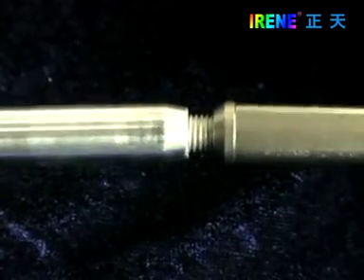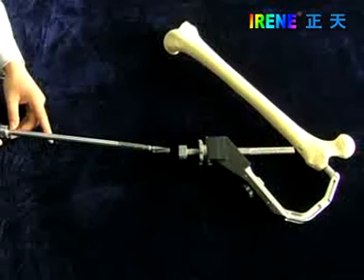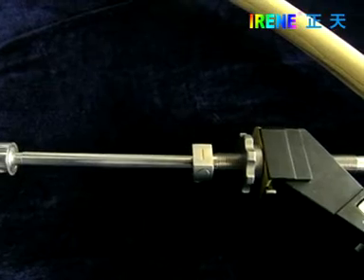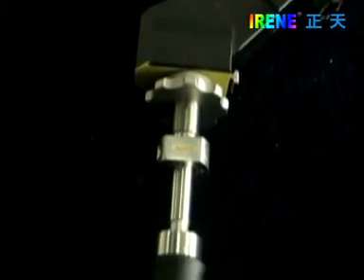Use the screw inserter to connect with the blade and insert the blade into the femoral head. And then use the hammer for further insertion.